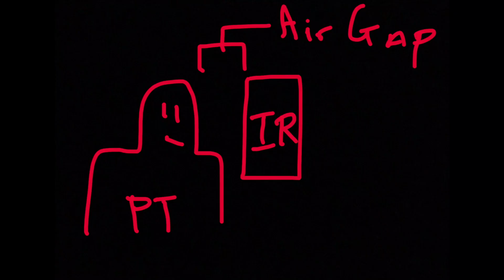So I think about the lateral C-spine. Lateral C-spine is going to have air gap technique. As your x-ray is coming in and hitting your C-spine or your neck, my film's over here, and as soon as that x-ray hits anything, it's going to start scattering.